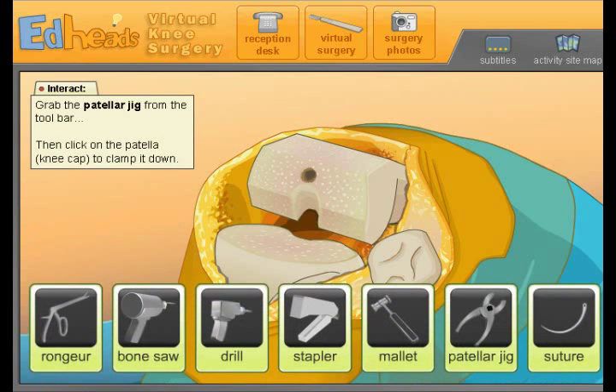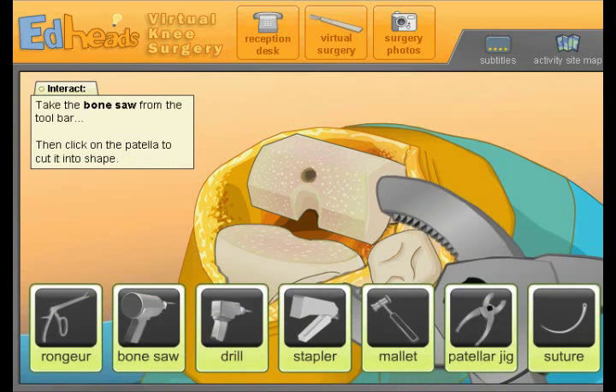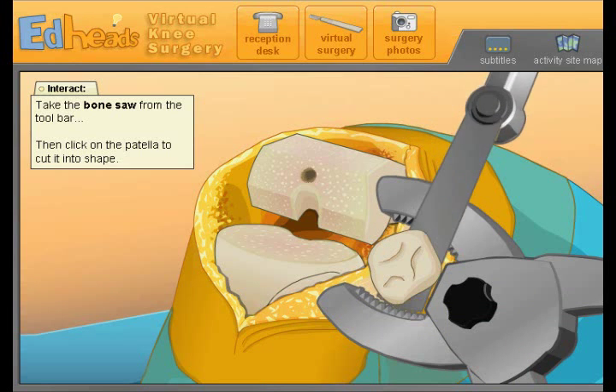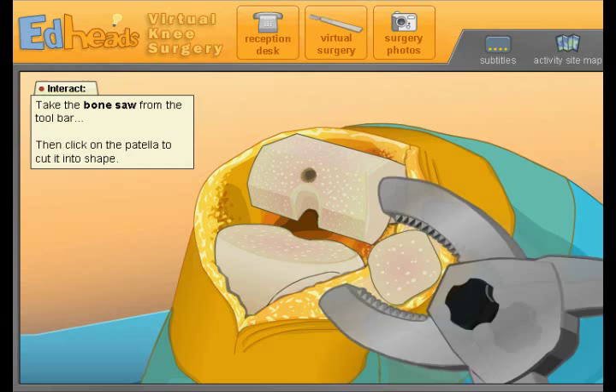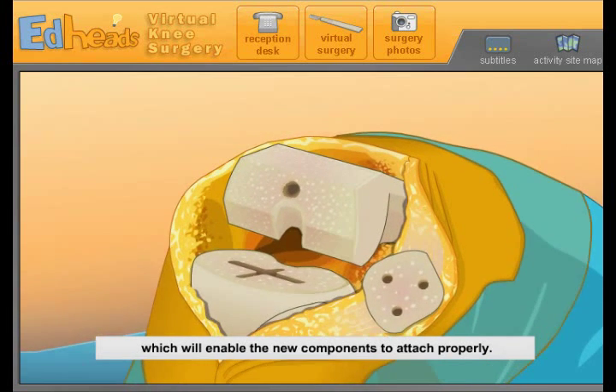Now we'll use the patellar cutting jig and bone saw to remove the back of our patient's patella. Oh, now we're going to cut off his kneecap. Ew, yeah, that's your kneecap. Holes in the tibia and patella are drilled and chiseled out, which will enable new components to attach properly.